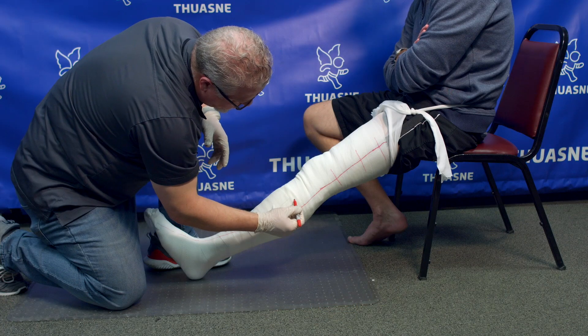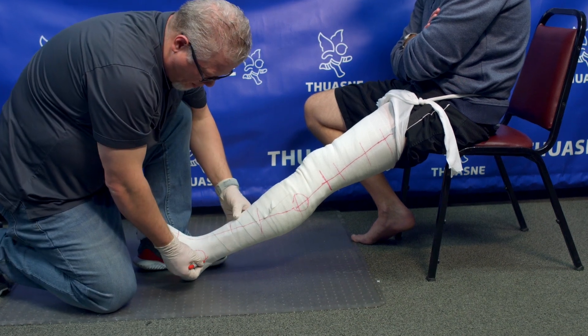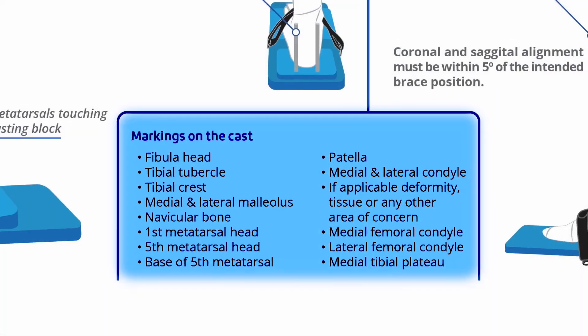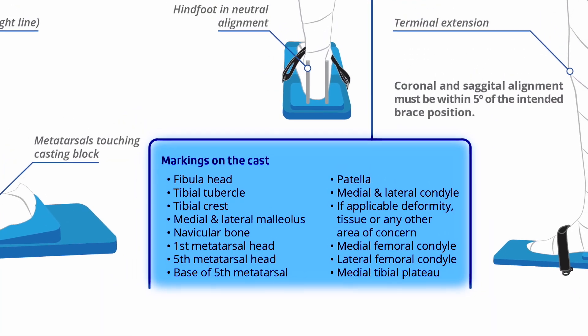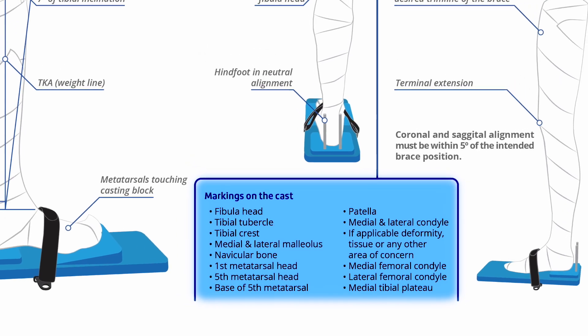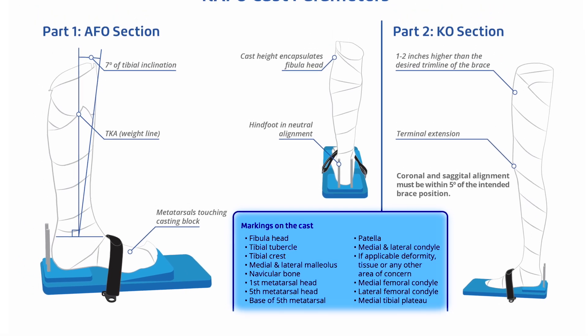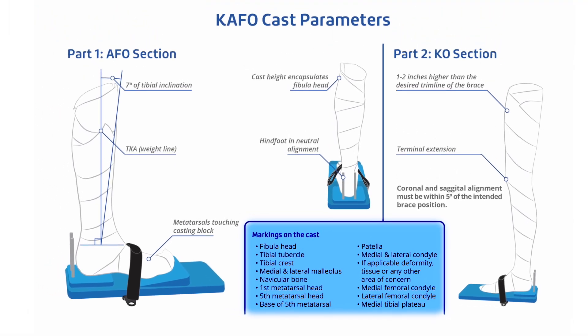Once the cast is almost cured, draw hash marks over the cut strip. Mark the landmarks on the outside of the cast: fibula head, tibial tubercle, tibial crest, medial and lateral malleoli, navicular, metatarsal heads, base of the fifth, patella, medial and lateral condyle, and any other area of concern.